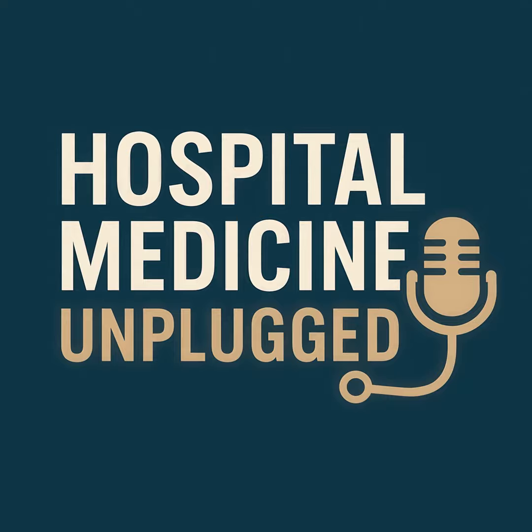Just for dyspnea relief? Primarily for dyspnea relief, yes. It can reduce that sensation of air hunger and decrease the work of breathing, sometimes providing more comfort than just opioids or anxiolytics alone. The absolute key here, though, is crystal clear communication and documentation. It must be explicitly documented that the NIPPV is being used solely for palliation of symptoms in alignment with the patient's established goals of care, and not as an attempt to reverse the underlying disease or prevent an expected death.